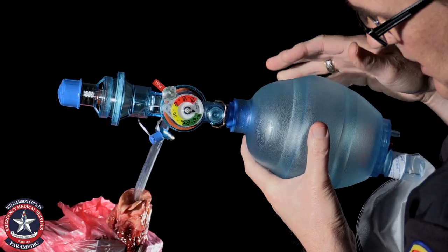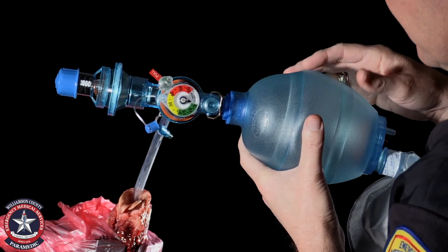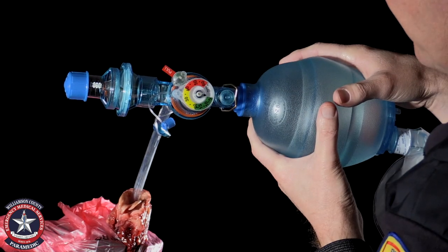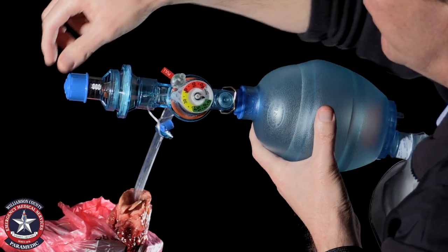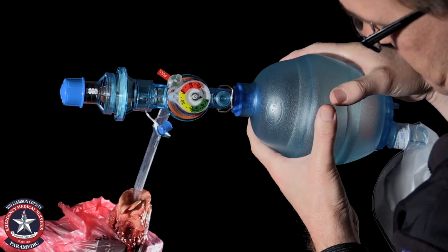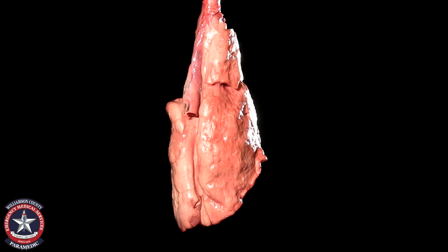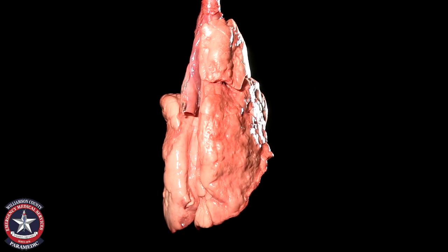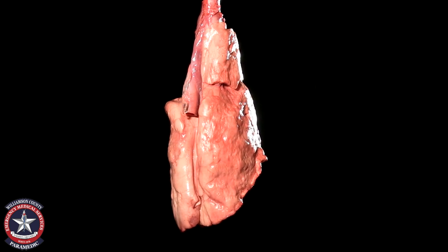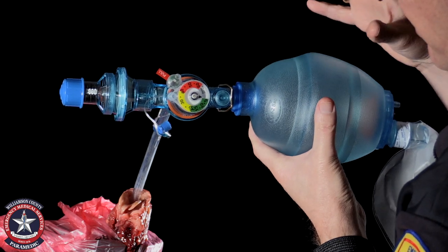Obviously this is an artificial scenario — this animal is dead. I am now bagging with zero PEEP; this is as far off as it can get. The thing to notice is that the lungs expand partially but then they collapse.